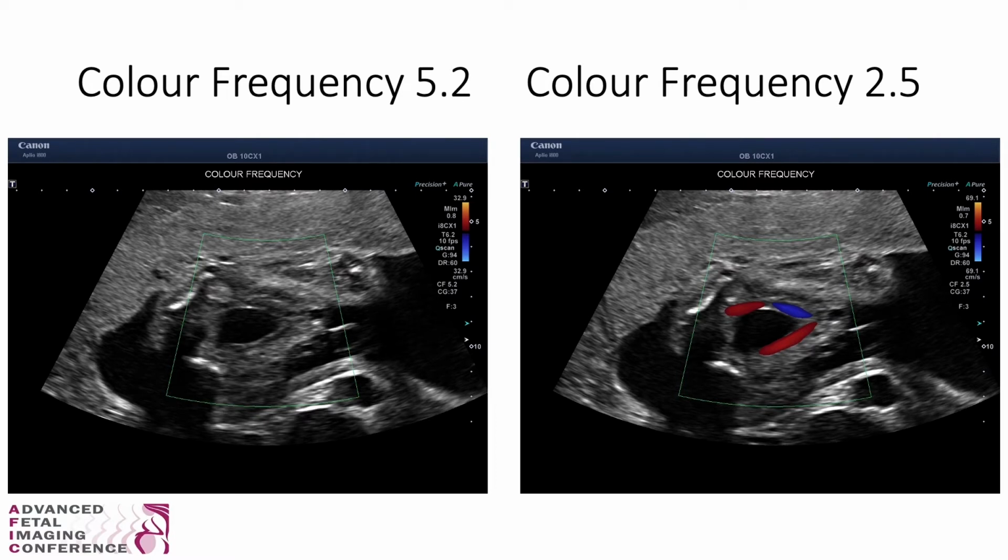One common error we see in obstetrics is being referred for a single umbilical artery. As we all know, there is an increased risk for cardiac anomalies in light of a single umbilical artery, and the patient must be counseled on this and sent for a fetal echo. As technologists, you may not realize the implications as a sonographer, but this can often and will often induce a significant amount of stress on the mother and her partner. Now they have been told they have a high-risk pregnancy.